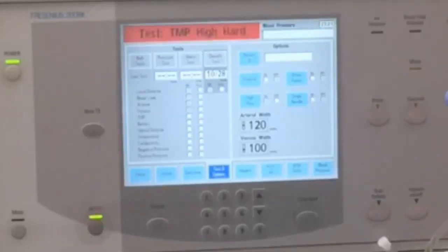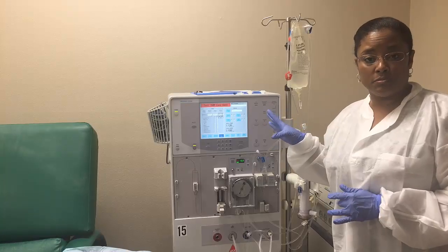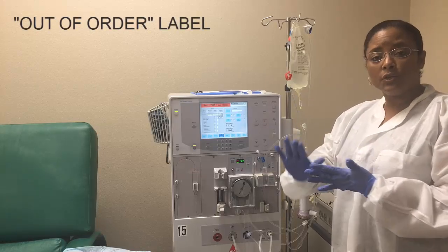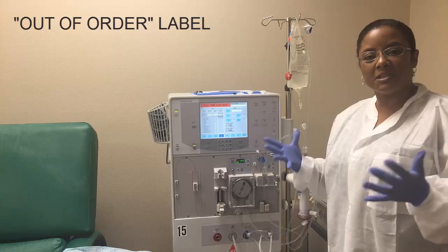And remember, if you are going to place this machine in the back, you want to place a label that says 'do not use,' 'out of order,' or something like that.